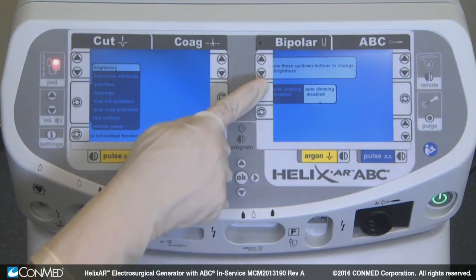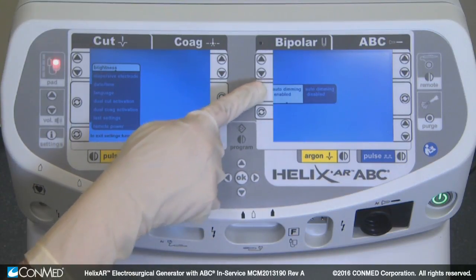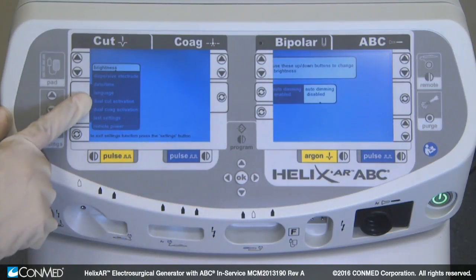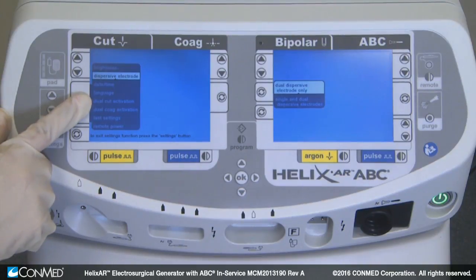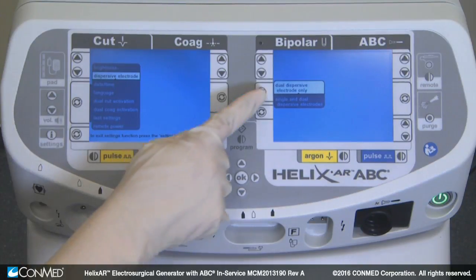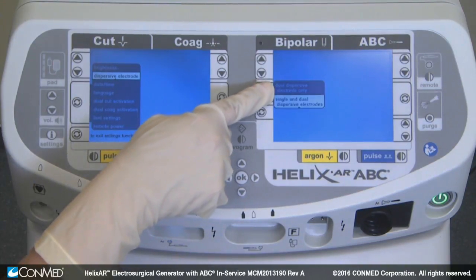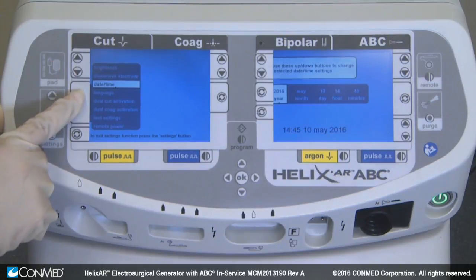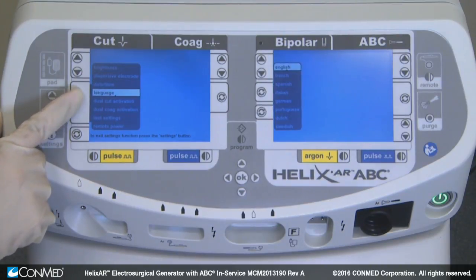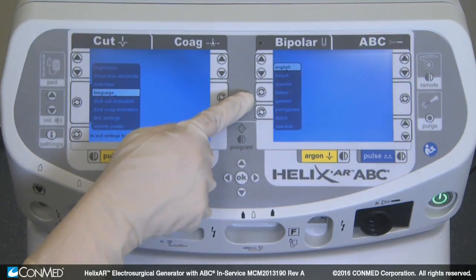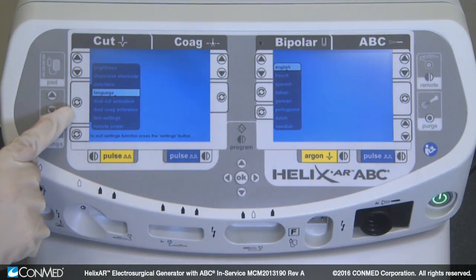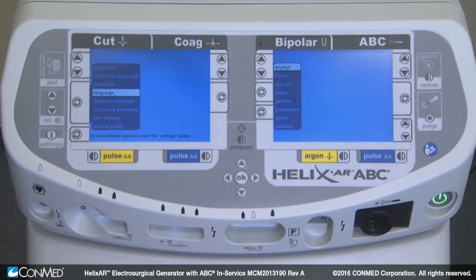Brightness can be adjusted manually or automatically. The dispersive electrode option can disable the use of single foil pads. The language setting provides the option to display text on screen in one of several languages.